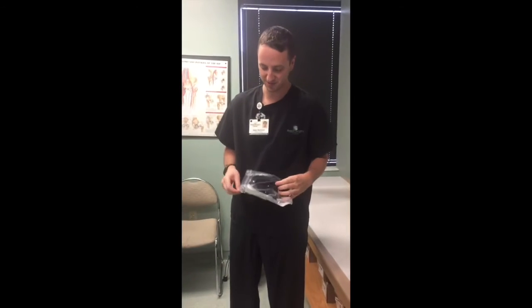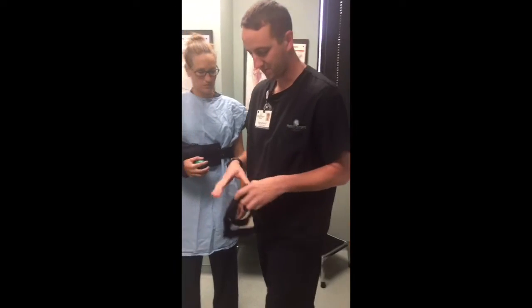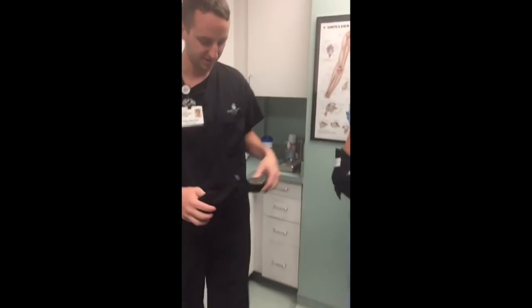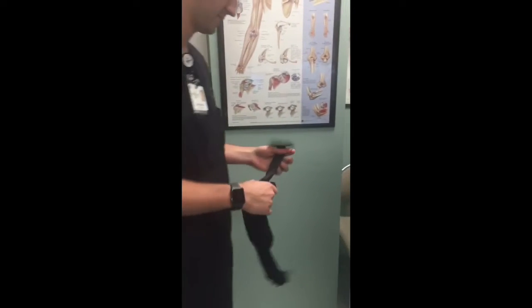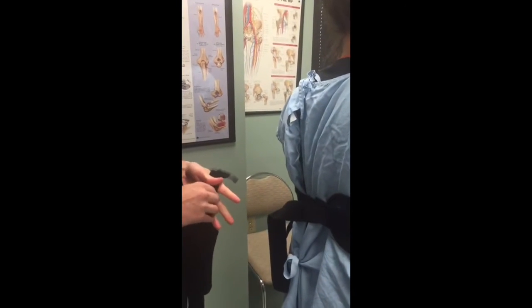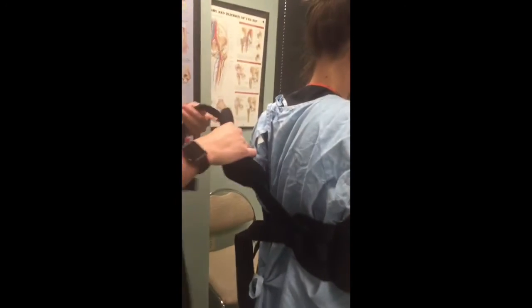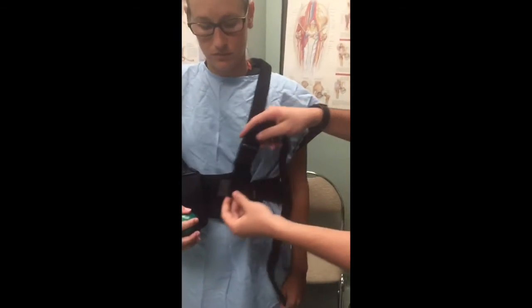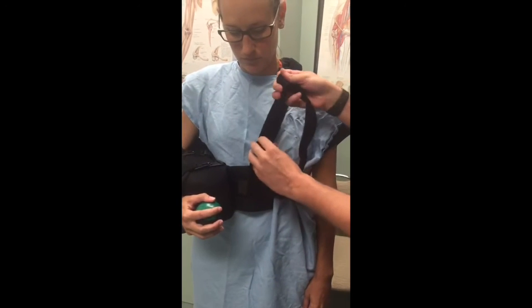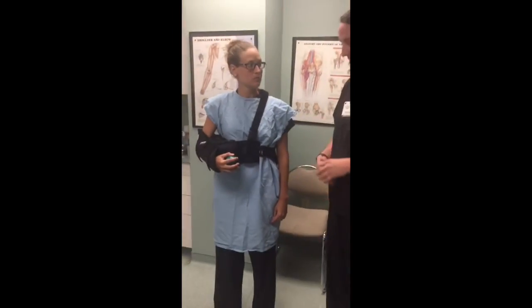But if you do want to add a shoulder component, there is an extra strap in the back here, which you can add to give support around the shoulder. This one has two simple straps. The first one will be strapped on the back part of the sling. And first one will go right here. And while going around their non-operative arm and shoulder, the second part of the Velcro will attach down front here. And again, this part can be pulled tight to the patient's preference. And this is the proper way to wear this shoulder sling.